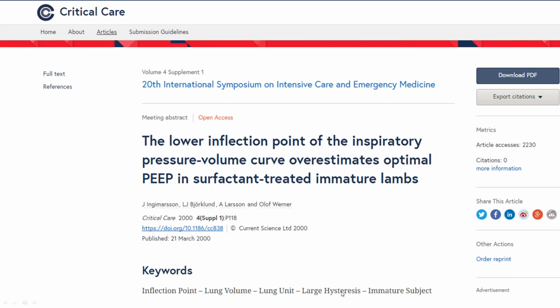And he saw that hysteresis was really a big problem in the patients with zero PEEP. It took them a long time to get their alveoli open as compared to the patients who had a higher PEEP setting according to their lower inflection point. So if you're ever questioning what to set the PEEP at, this may be one strategy.